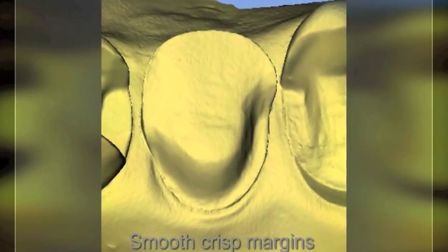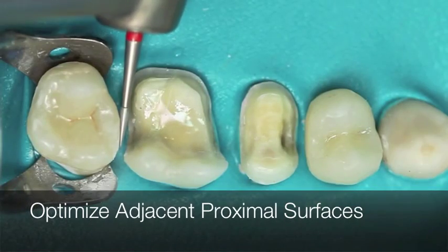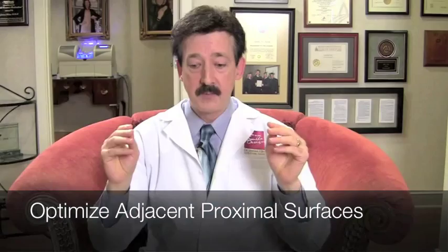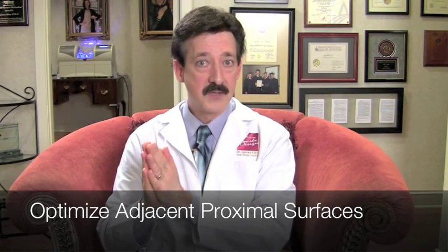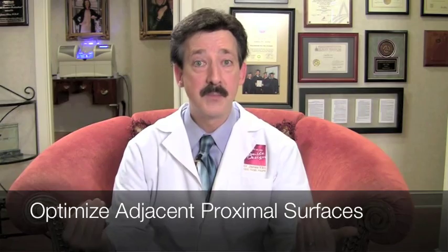When you're preparing multiple teeth or one tooth, you want to make sure that the draw of your preparation is in alignment with the proximal contacts next door. Eight out of ten times, I would enamelplasty the adjacent proximal contacts. Number one is I want to optimize my contact zone so I have great embrasure form and don't have buccal-lingual food impaction issues.